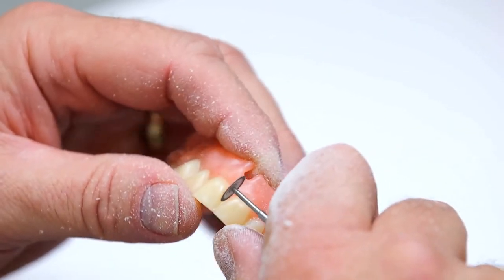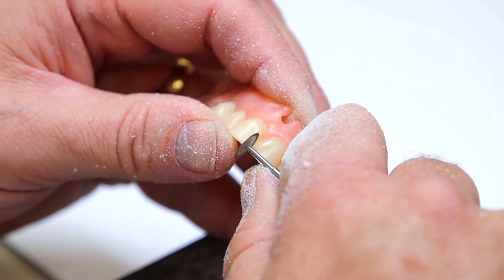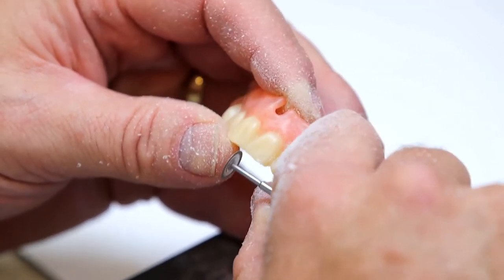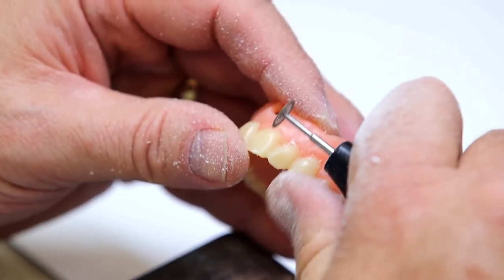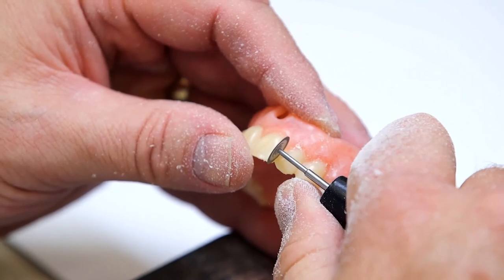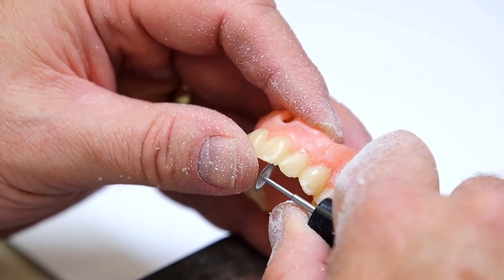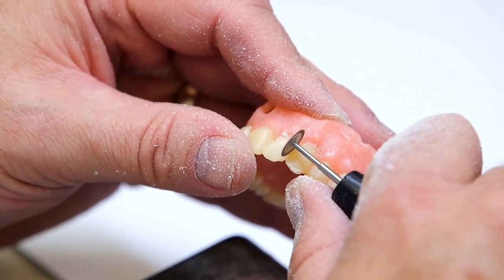I'm just going to take this disc and go very slow right in the interproximal area. Just do a nice little cut just to open the embrasure, maybe round that incisal edge off. For the crown and bridge technicians, this is going to be relatively easy for you, other than it is PMMA material, so it cuts a lot faster than a ceramic.